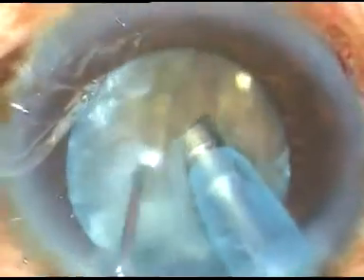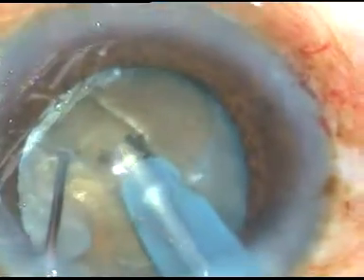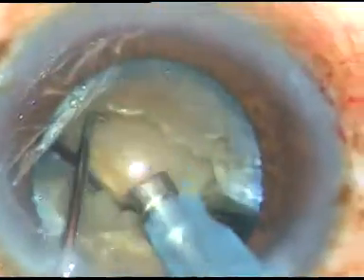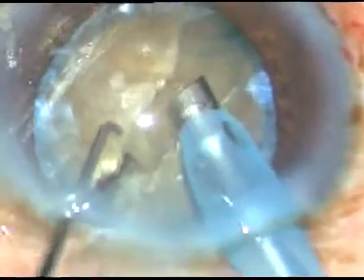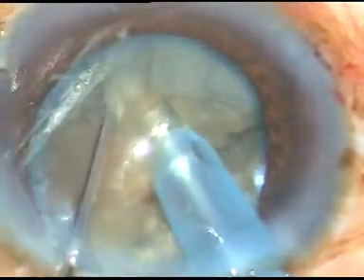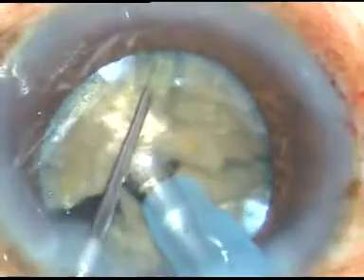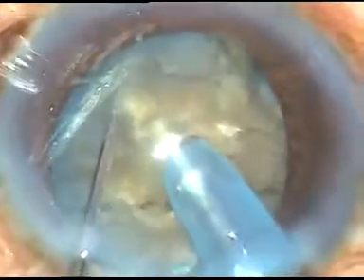So I rotate it 180 degrees. I make this groove a little deeper and now I apply opposite forces, and along that crack the nucleus divides into two halves. Now each half is being subdivided into three parts because this is a large nucleus. Each hemi-nucleus is divided into three fragments.